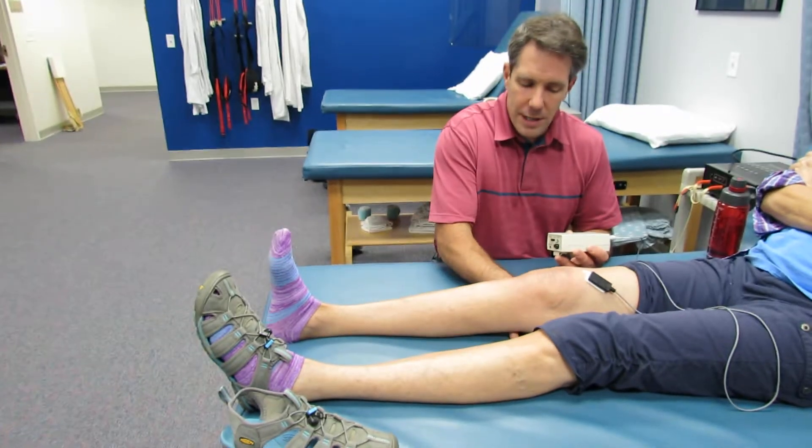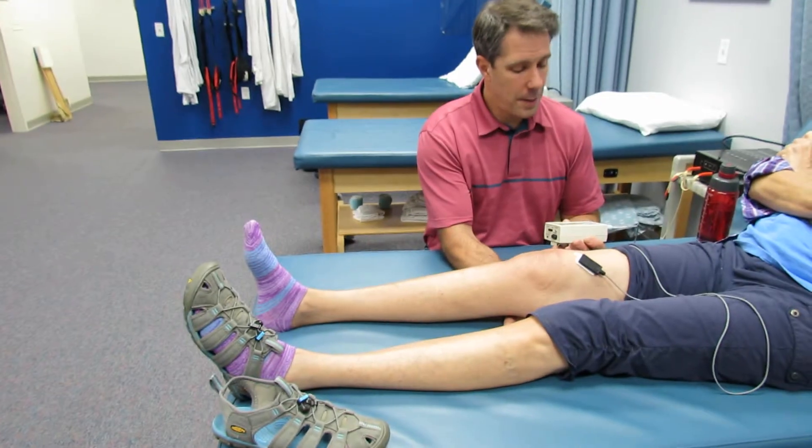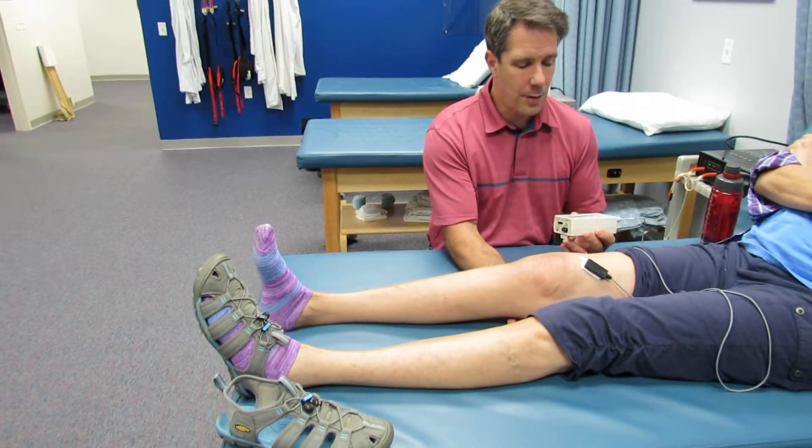I'm going to put my hand under there — sometimes just putting a small towel is enough. Go ahead and push down into my hand, push hard, and you can hear we have now met the goal. And relax.